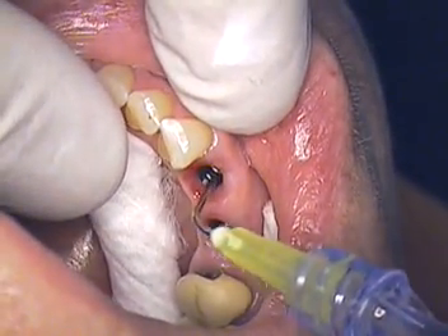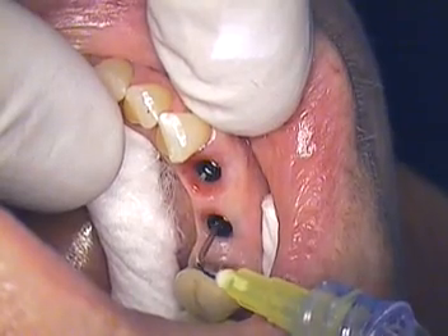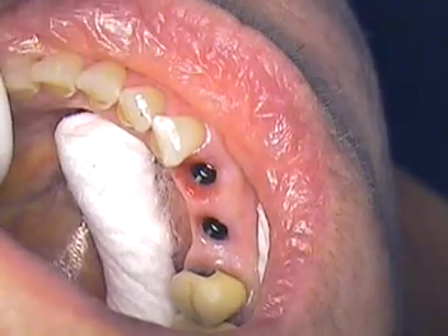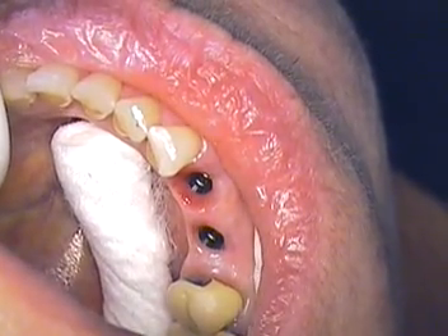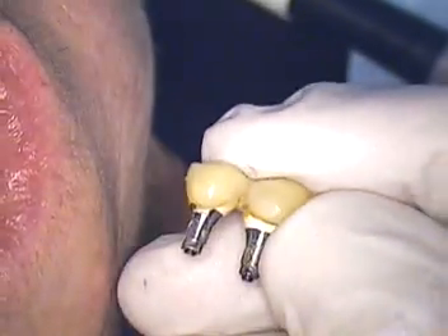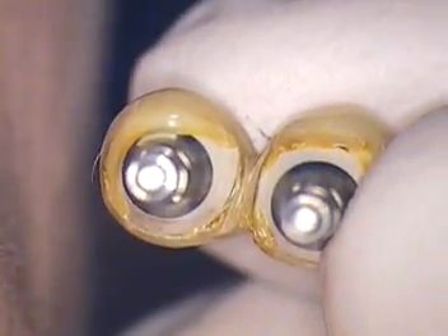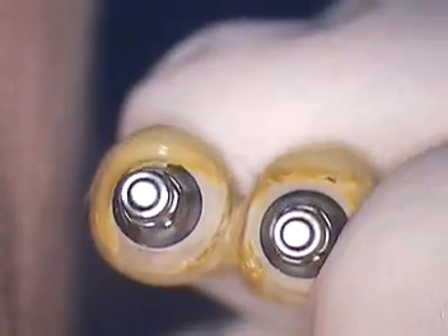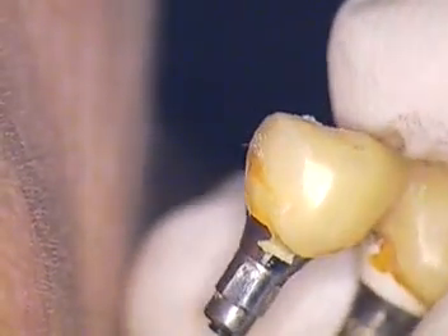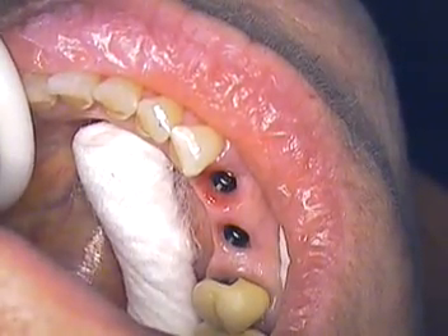We're now at the point where we've adjusted the contacts. There was a little trouble with the lab work — trying to get the contacts perfect. Let me show you where we started. This is the provisional. Of course it doesn't look like the day we put it in because it's all stained. You can notice on the surface how well we tried to keep intact the highly polished surface. That being said, this is out — we're going to go in with the real McCoy now.